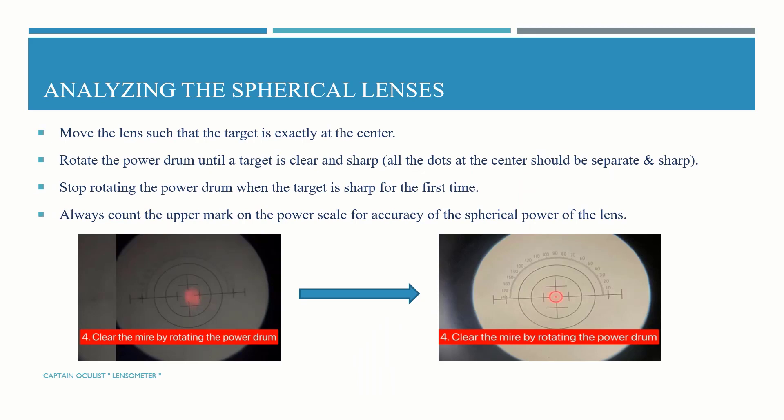Analyzing spherical lenses: move the lens so that the target is exactly at the center. Rotate the power drum until the target is clear and sharp. All the dots at the target or at the center should be separate and sharp. Stop rotating the power drum when the target is sharp for the first time. Always read the upper mark on the power scale for accuracy of the spherical power.